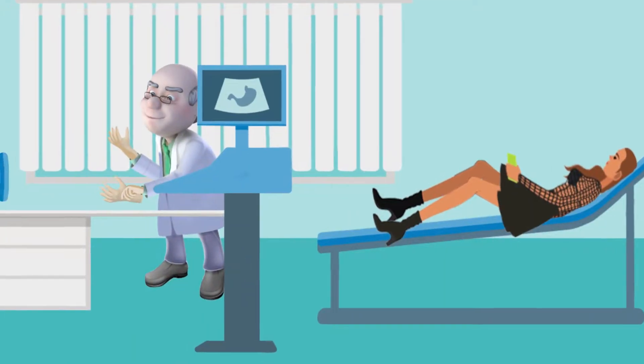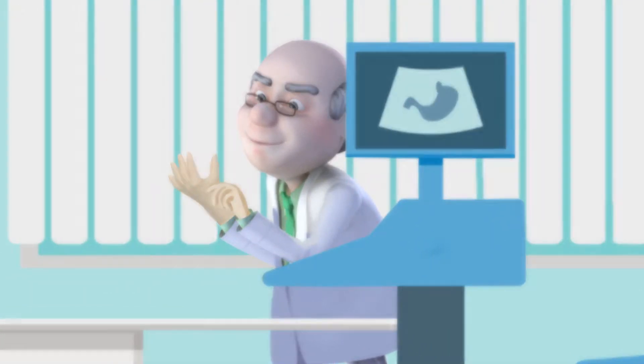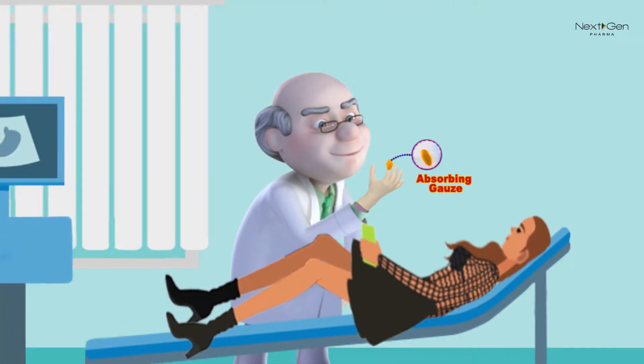Take out the glove and insert your right hand in the glove. The glove has absorbing gauze on the index finger and pH paper on the thumb.